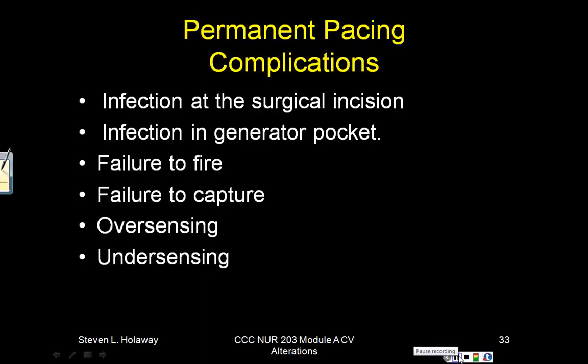Other complications are failure to capture, oversensing, failure to fire, and undersensing. I'm going to discuss a little bit more per se in each of their own little slides.